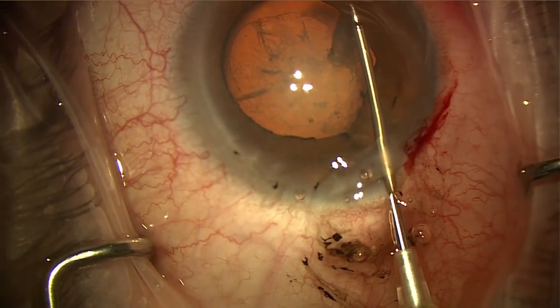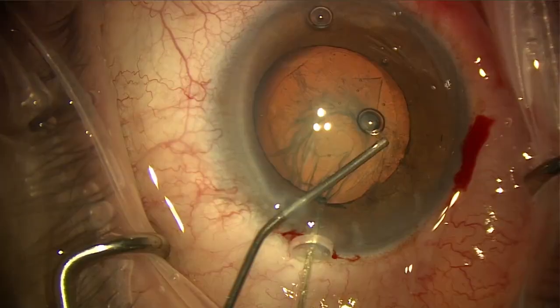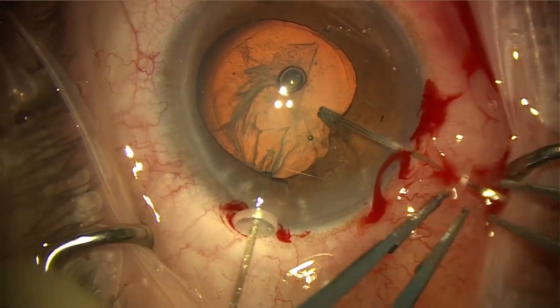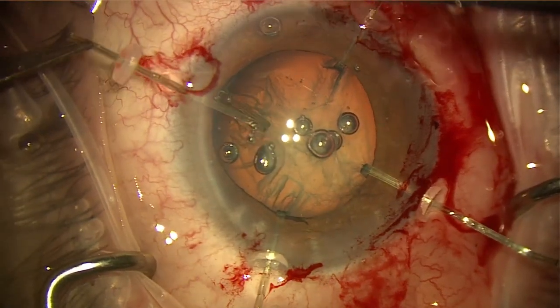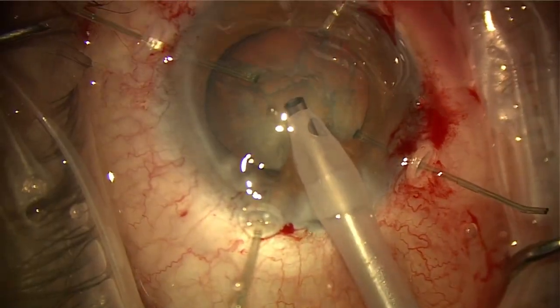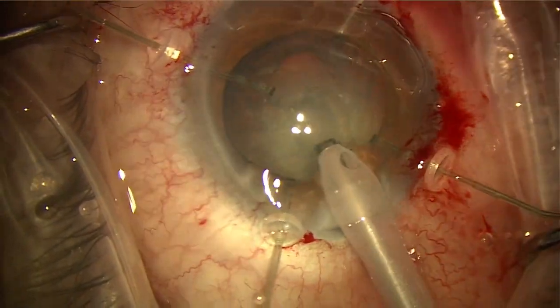The iris is also trying to prolapse out of the wound, but we managed to continue and complete this capsulorhexis using a MST micrograsper. Due to the significant zonular laxity here, we're going to use some MST Chang capsular hooks, and we place 4 of these through to allow stabilization of the zonules.